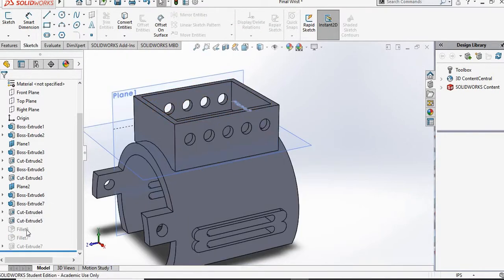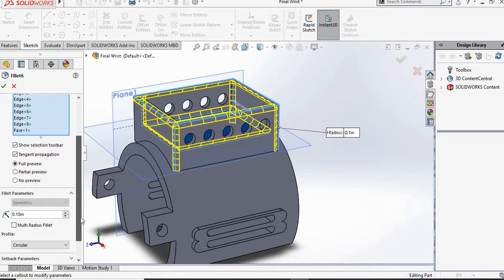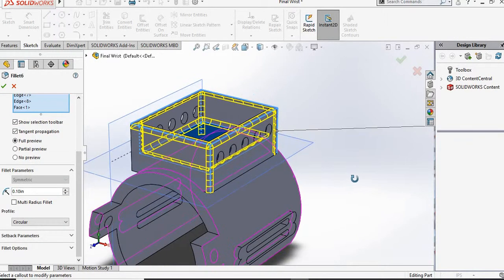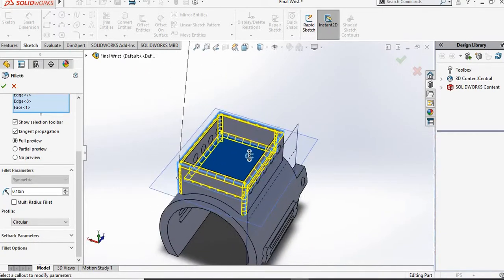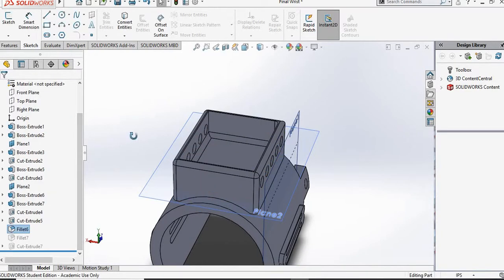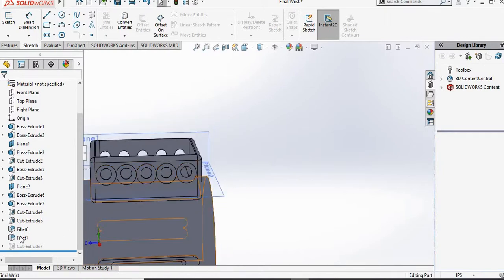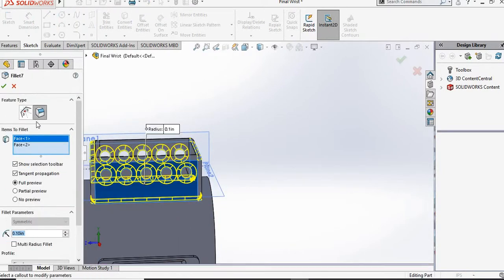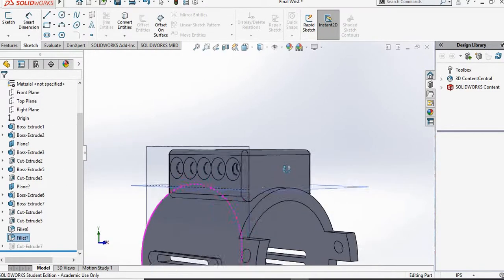Alright, so we went ahead and used the fillet feature onto the edges of our rectangular box. And this fillet had a radius of 0.1 inches. And again, these are the edges that we created our fillet for. So we did on the inner edges and the outer edges. Then we went ahead and used another fillet feature on our holes. And again, this is what they look like. This is what the final result looked like. And that radius was also 0.1 inch. Okay, so the hole should now look like this.